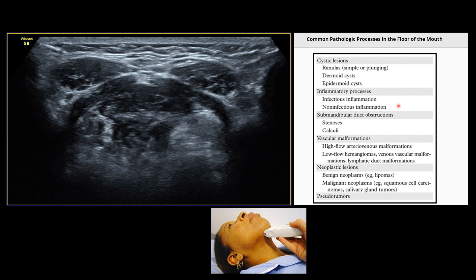Neoplastic lesions can also be encountered: benign ones such as lipomas, and malignant ones such as squamous cell carcinomas or other oral malignancies. Pseudotumors can also be seen in this floor of the mouth or submental space view.